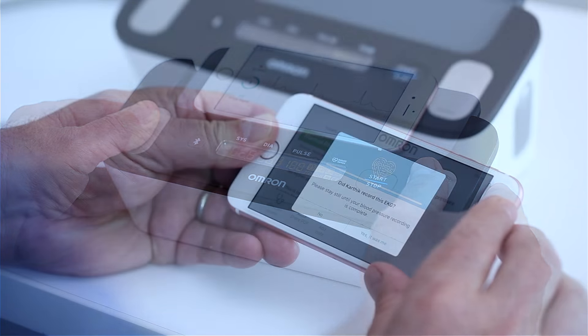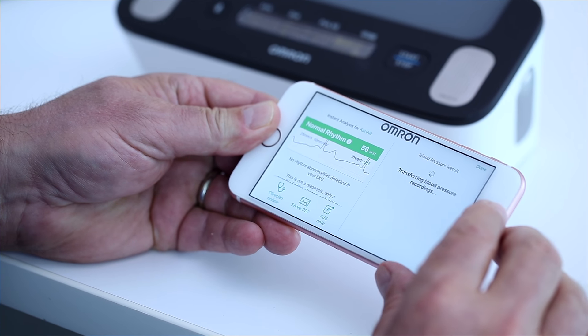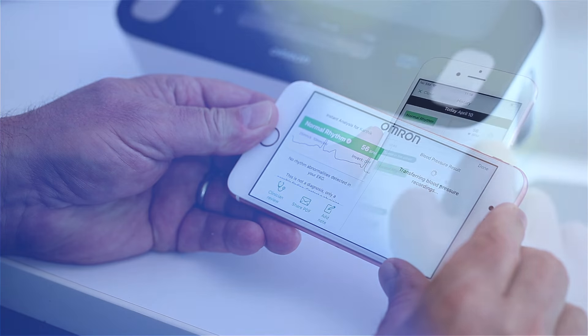Step 7. Once the measurements are complete, your results are automatically transferred to the Omron Connect app for further review or to easily share with your doctor.